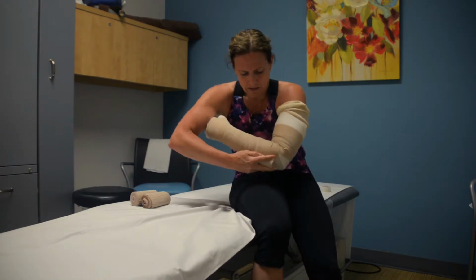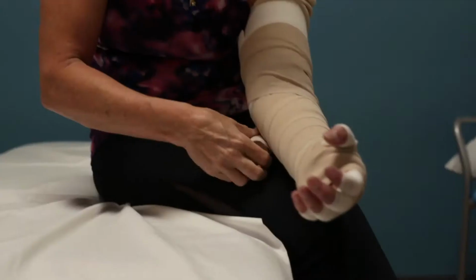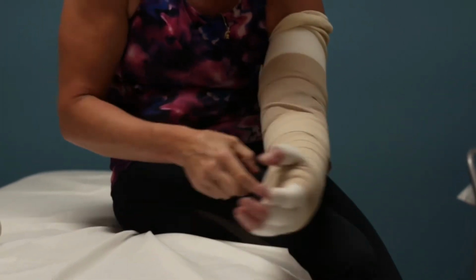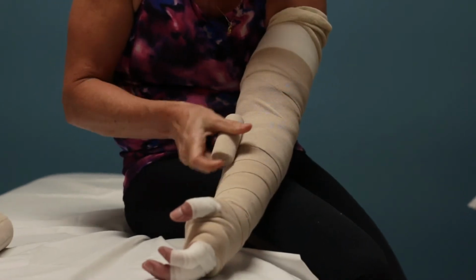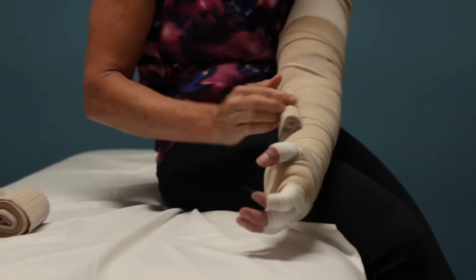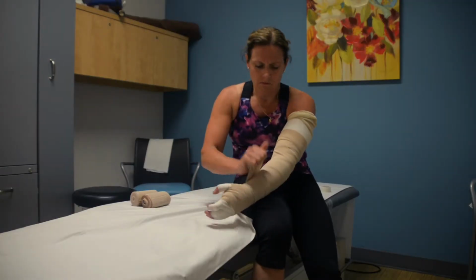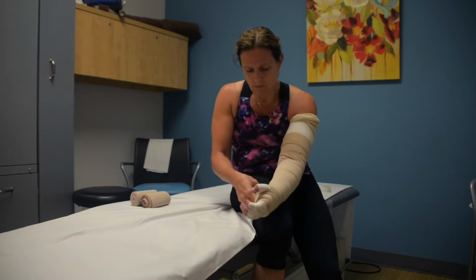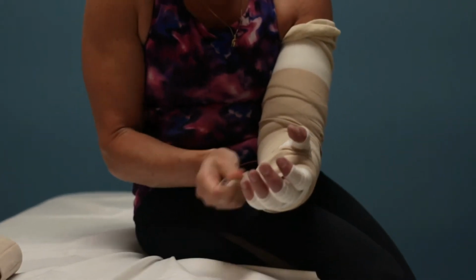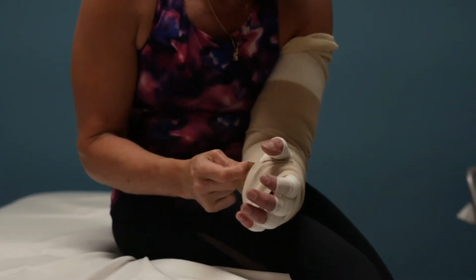So you've got to exit the elbow. And with what you have left over, you're actually going to go down towards your hand until you run out of short stretch bandage. And then I tuck this in too. If you can find a place to tuck it in, great. If not, you can tape it.